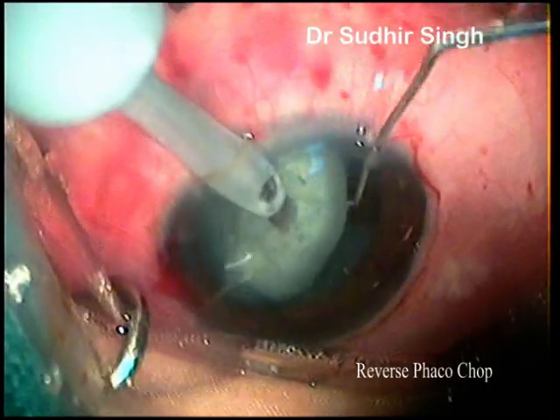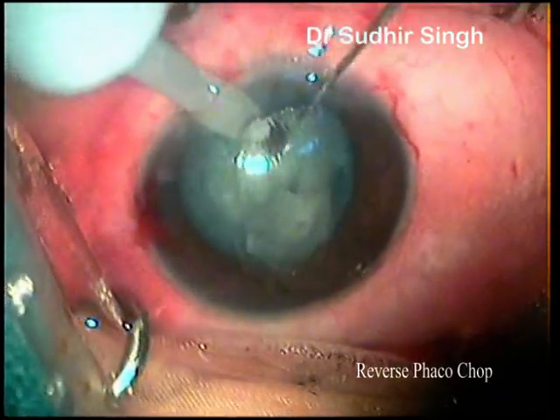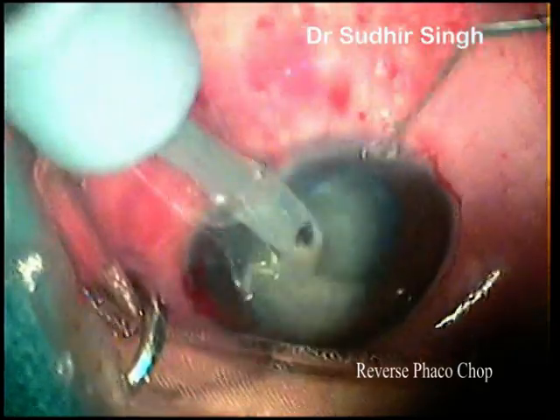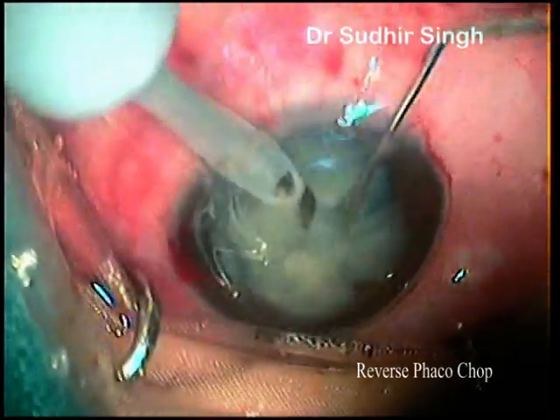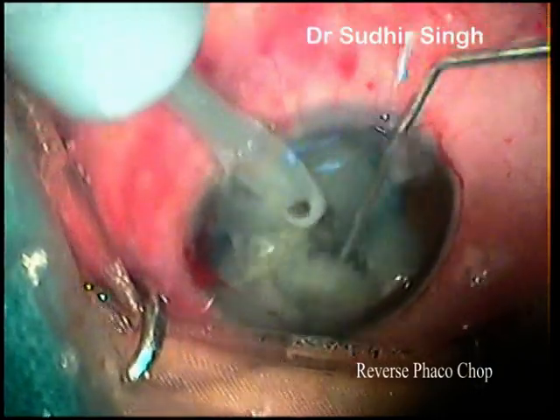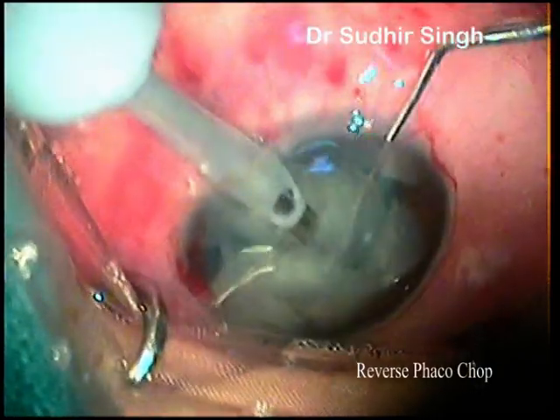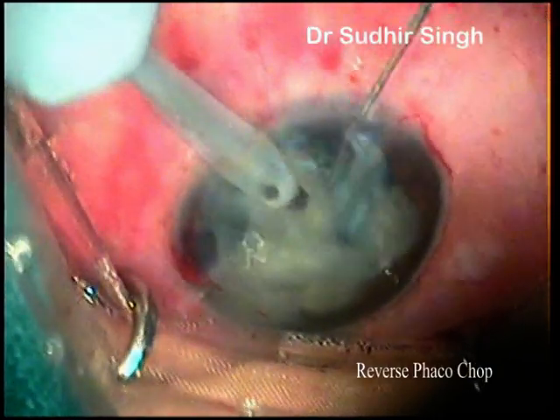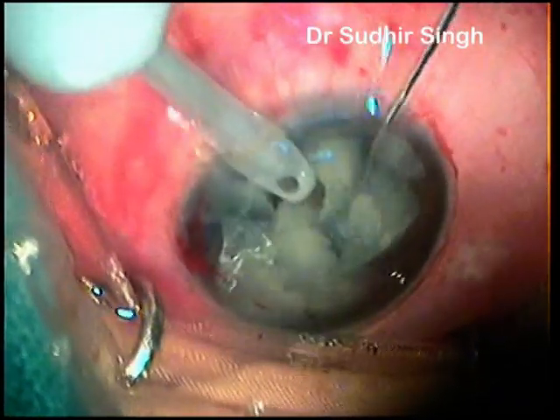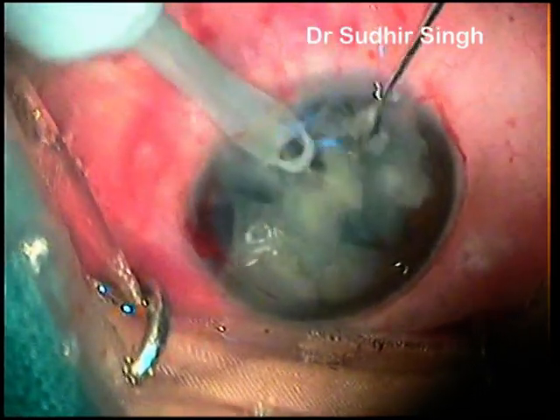We use the reverse chopped nucleotomy technique in intumescent white cataracts. The phaco probe tip is buried into the nucleus, then the nucleus is lifted up. The chopper is then moved from the posterior pole to the anterior pole of the nucleus and the nucleus is chopped. This process is repeated multiple times to create small nuclear fragments. Each nuclear fragment is emulsified one by one.